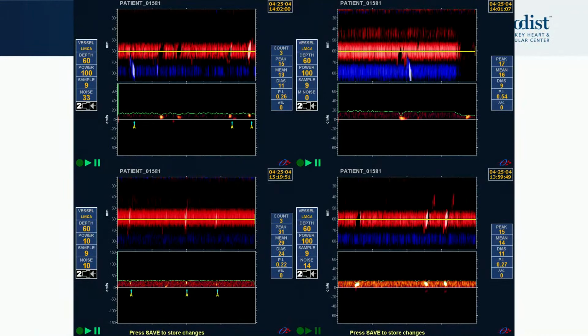When we monitor the bypass, it's so much easier to see the microembolic signal, because you don't have the pulsatility anymore. So when you don't have a pulsatility, all my AI buddies have an easier job to find, here's a slow, here's a fast. So with the same speed blood flow, you can really easily differentiate, this is a big piece, this is a smaller piece. So this is how I'm using a little bit of sizing these. And again, almost I can see that when the signal is deleting, these are maybe microemboli.